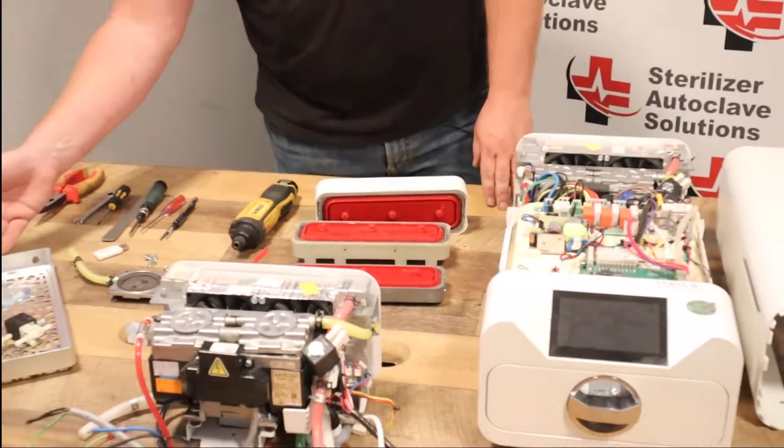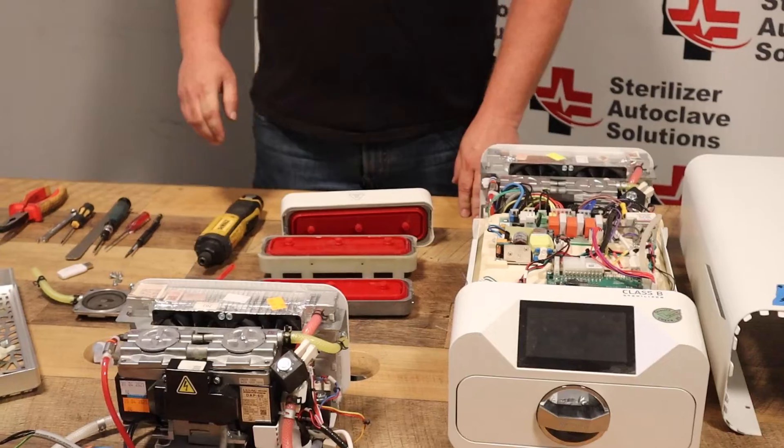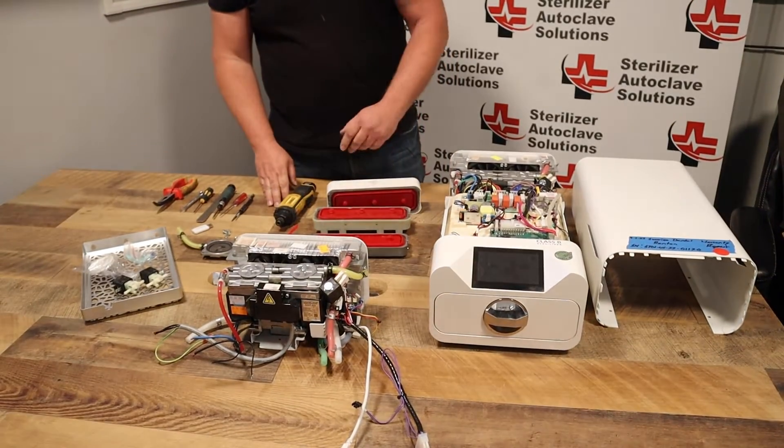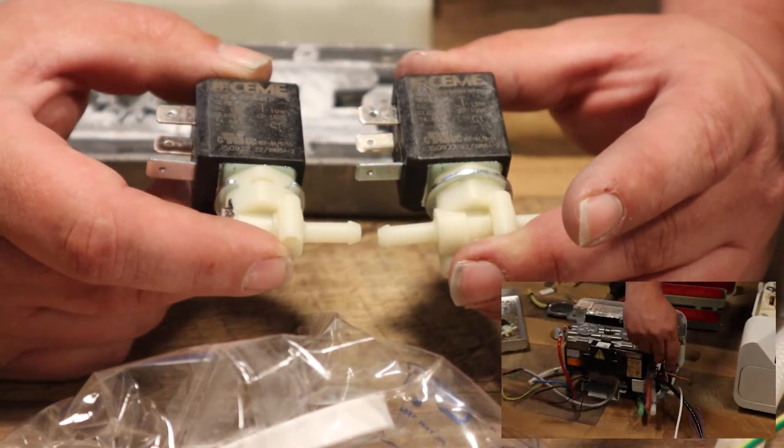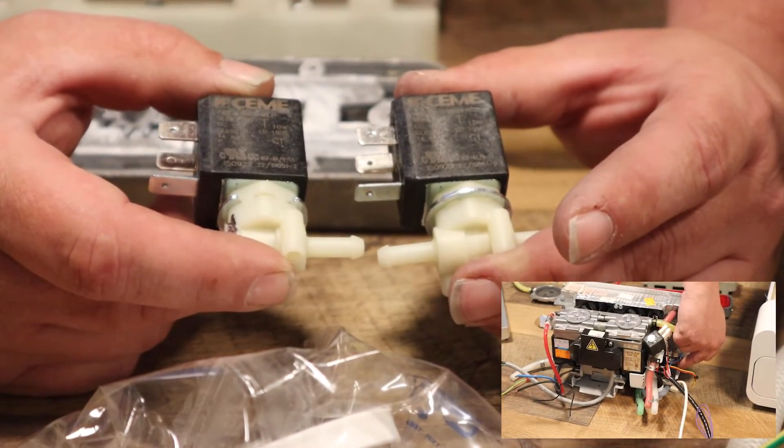If you put it in backwards, your tray will not lock into place. From that point, once you complete your door, you would move to the back of the unit to replace valve two and valve five right here.